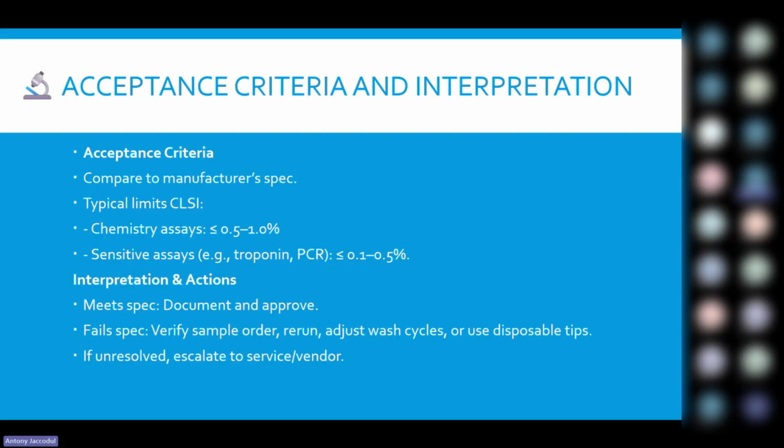I think we are very much fans of CLSI in this part of the world. There's also the German bit. We also have the RCPA and all those particular things. So it depends on the guidelines that you're using in your lab. But you should also go back to the manufacturer acceptability criteria for various tests.